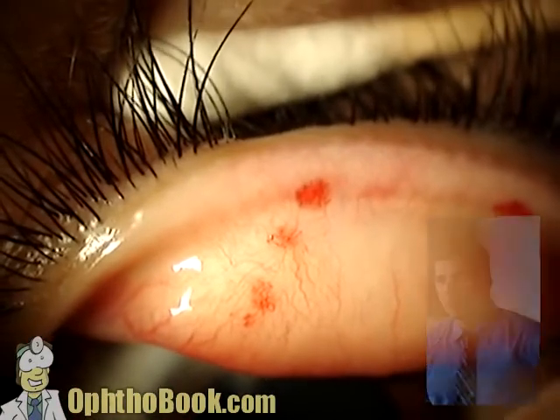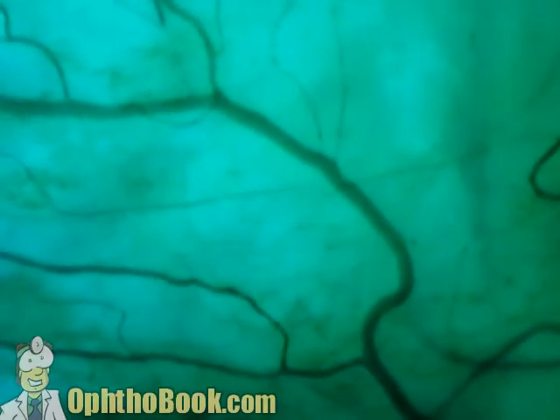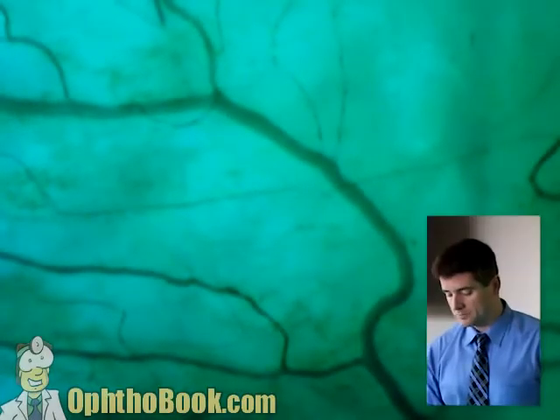You can also use the red-free filter when looking at the surface of the eye. Red lesions are much easier to see with this light. They become darker, they become black. In fact, you can even see the individual blood vessels coursing through the surface of the conjunctiva if you use this filter and you turn your magnification up enough.